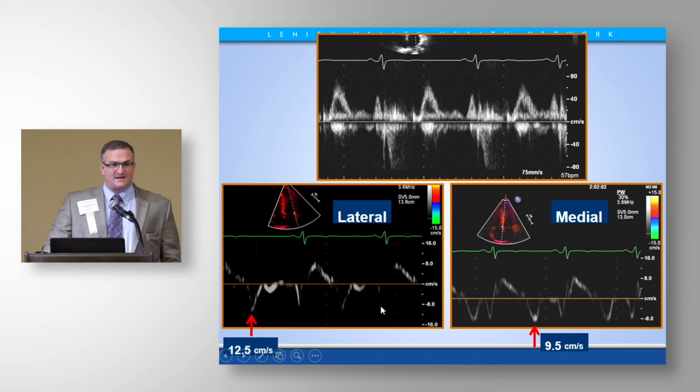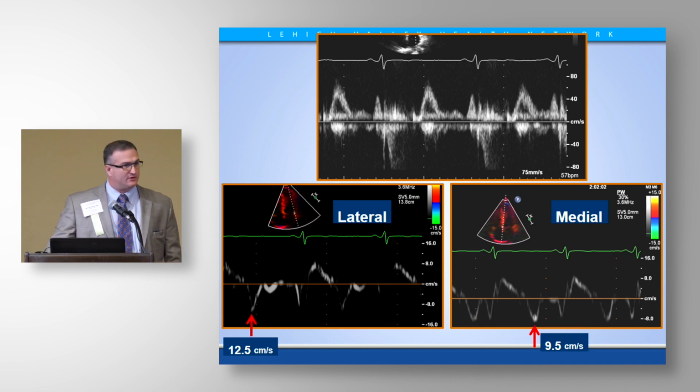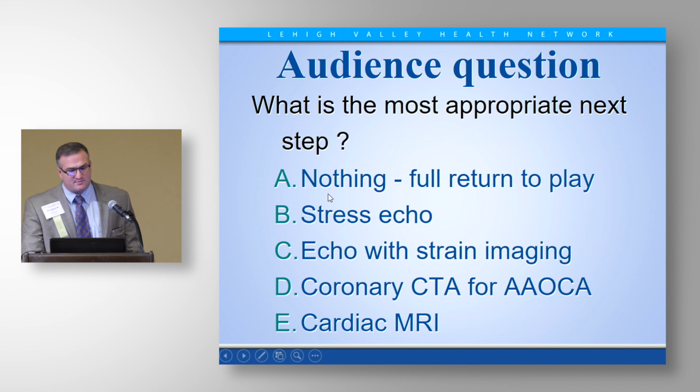There's abnormal relaxation within the heart, which is a sign that there may be some myocardial disease. So it's more than just the wall thickness. Thinking beyond that and understanding those echo reports is critical. So we sent him on, hopefully, for whatever the next step is.